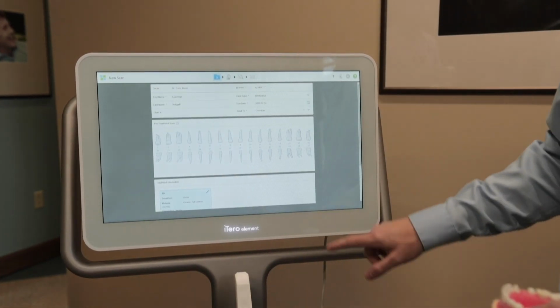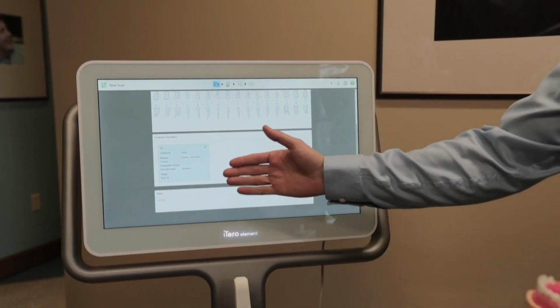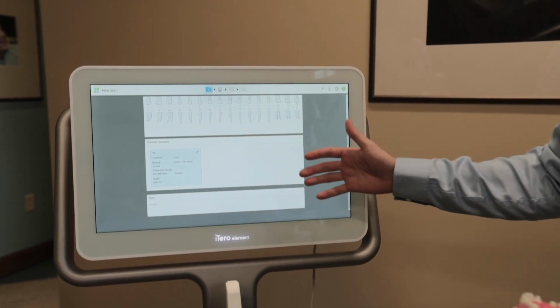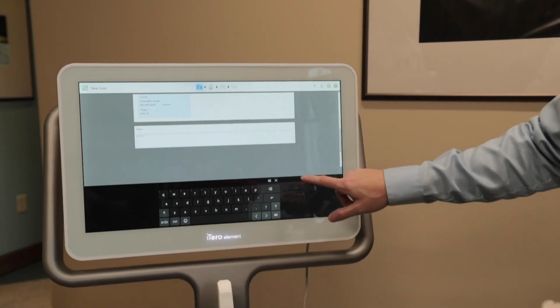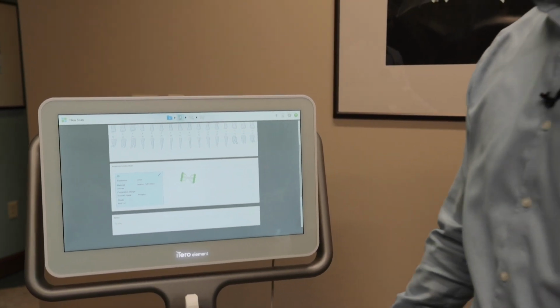All right, I'm gonna go ahead and select back. You have your box here that shows the tooth that you're ordering, 19. If you had more teeth that you were prepping, you would have subsequent cards next to it. And then we have a note section. If you did want to say any notes in here, you can go ahead and type them in to the laboratory. All right, we're then gonna hit the scan button.